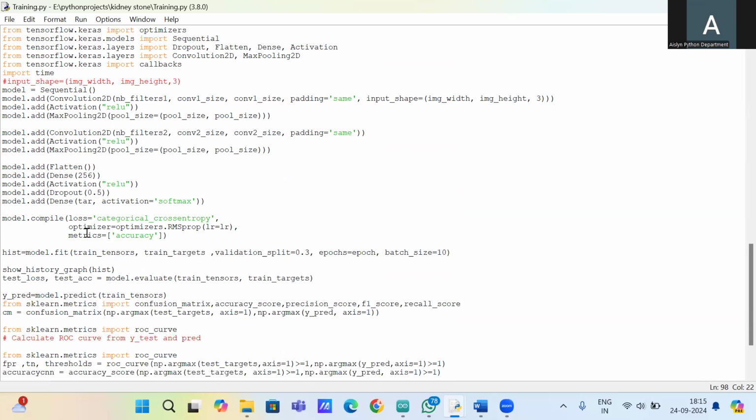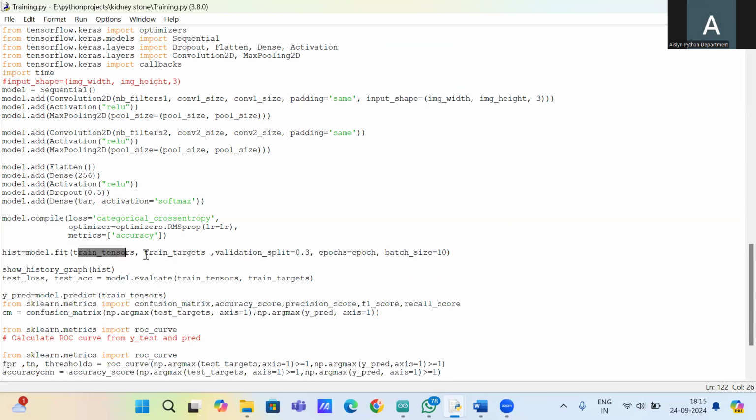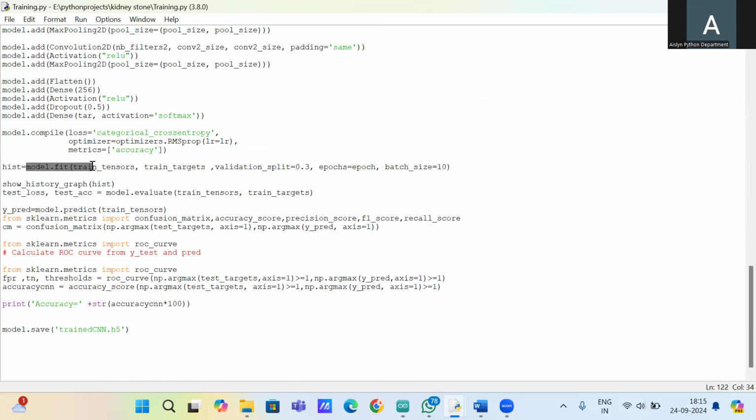And your model will be compiled, and here you give the train tensors and train targets. What you have given here will be used here. So we are fitting the model to the training values. For that, your model will be saved. Before that, you could see how the curve looks. The curve will show how well the model fits your data. So that you will see here. So it's a trained model. I'll show you the testing code.